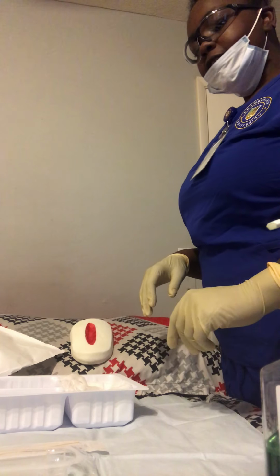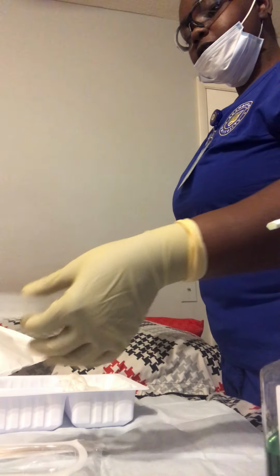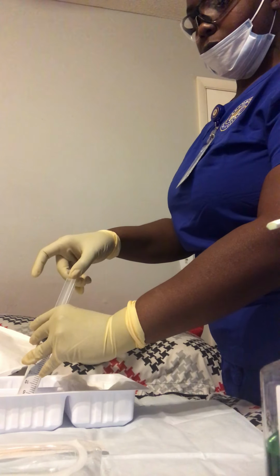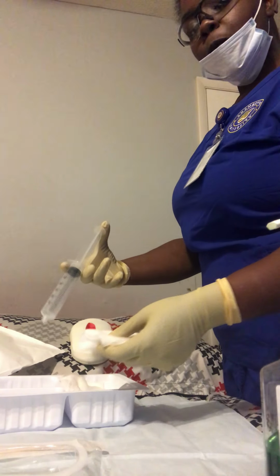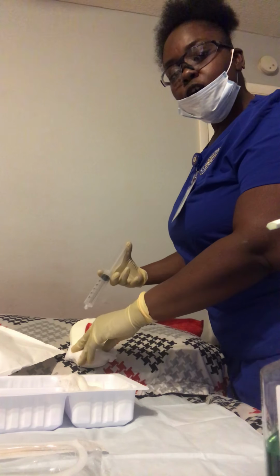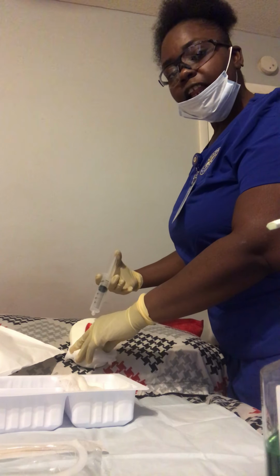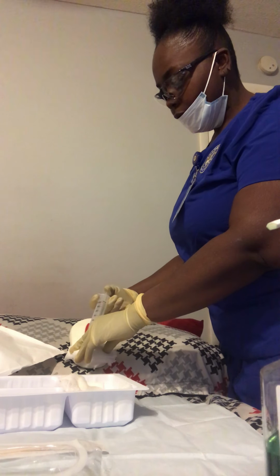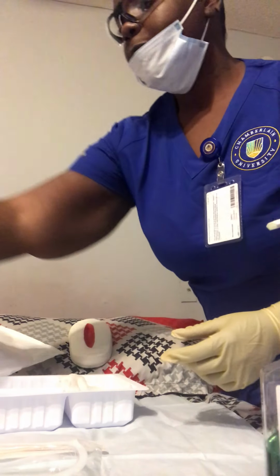Okay, so next I'm going to take a 35 to 60 milliliter syringe and draw up sterile solution to clean the wound. I'm going to take a gauze and place it under the wound while I'm irrigating it. You want to irrigate the wound from top to bottom, and you will continue irrigation until you receive clear fluid. Okay, we're going to dispose of that in the appropriate receptacle.